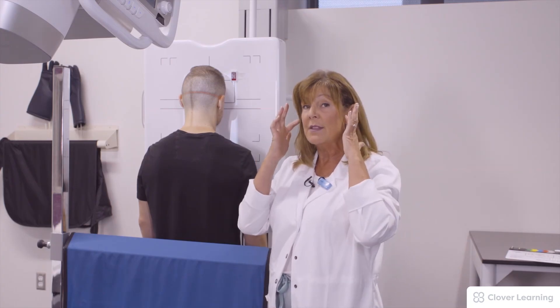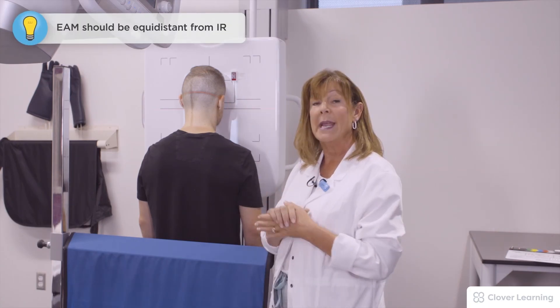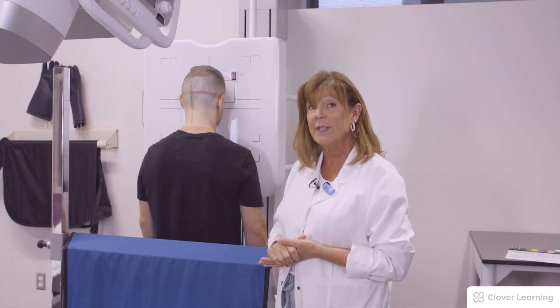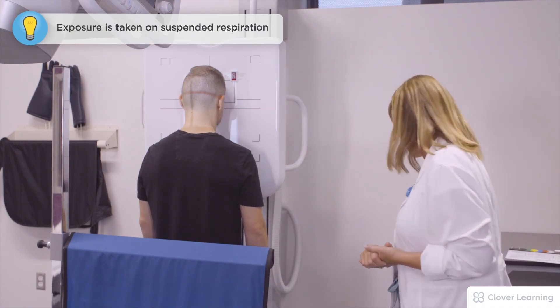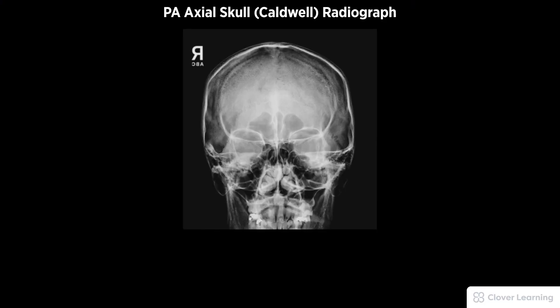I've also made sure that there was no rotation of the skull by confirming that the external auditory meatus, the EAMs, are of equal distance from the board. The patient will hold very still and the exposure is made. A diagnostic PA Axial Skull Caldwell view radiograph must be free of motion and rotation. Demonstrated anatomy includes symmetric petrous ridges, with petrous pyramids lying in the lower third of the orbit, and proper visualization of soft tissue and bony detail.